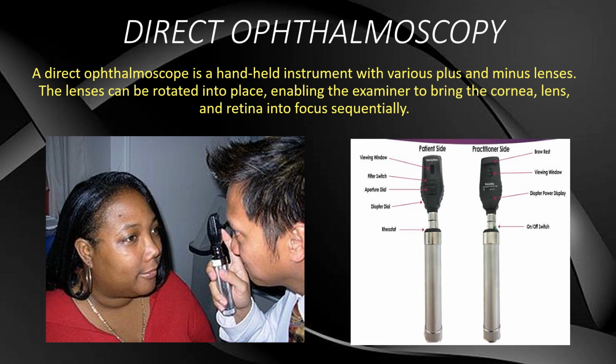The examiner mainly looks for intraretinal hemorrhages, which may appear as red smudges, and if the patient has hypertension they may be somewhat flame shaped. Lipid may be present in the retina of patients with mainly diabetes. This lipid has a yellowish appearance. The examiner may also look for microaneurysms and also for macular degeneration.